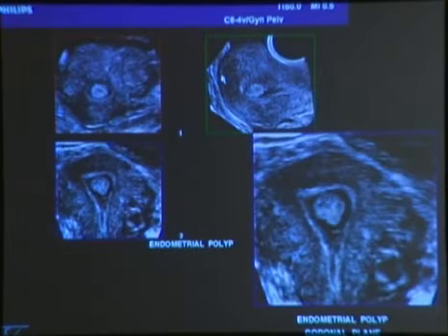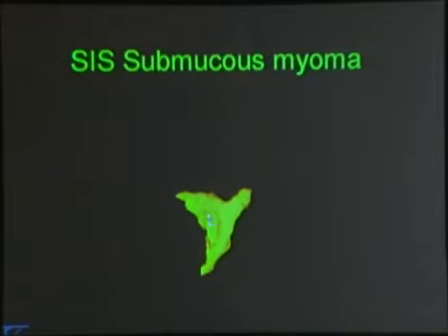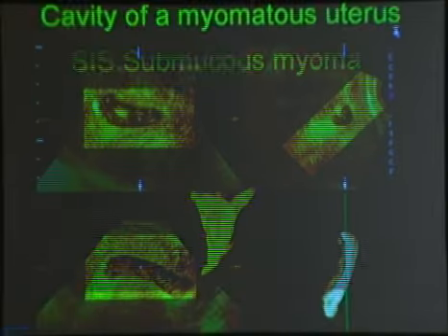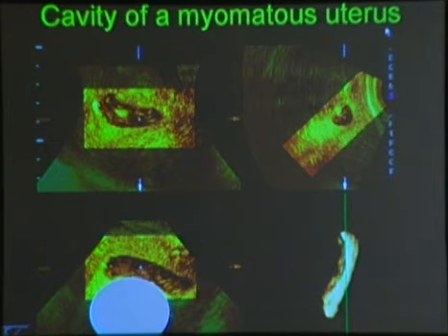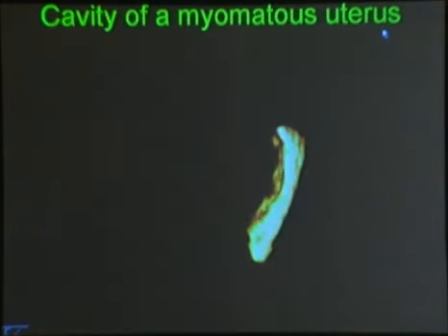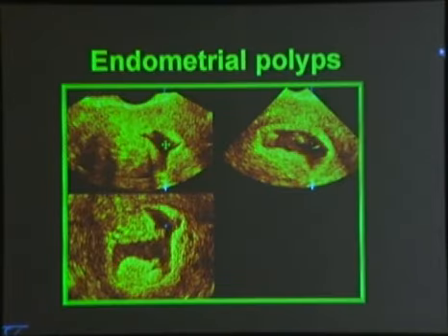Now, the endometrial cavity, I've shown you many pictures already. Several are shown here. You can also see where the fibroids are located, how they imprint on the uterine cavity. Once again, was shown before. This is important, whether to go in and take it out using a hysteroscopic surgical method or do it through a myomectomy in an open fashion. And once again, all the doctors come up and look at these and then plan their management of the case.